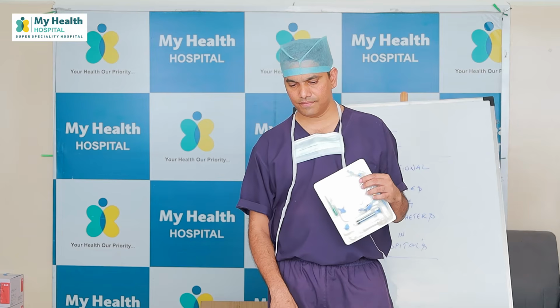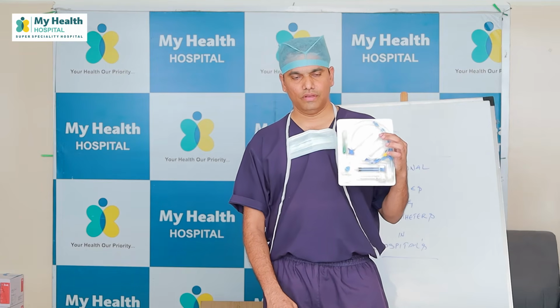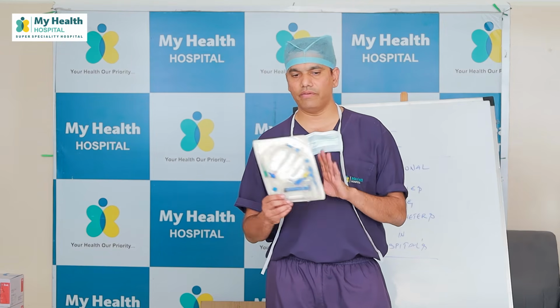Why are they putting a triple lumen? What is the need for a triple lumen central line? When we have a double lumen, why do we need triple lumen? We have a cannula. Why do we need this? More sick patients, we need rapid infusions, we need access to the central lines.